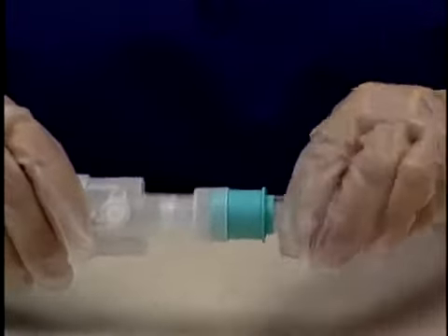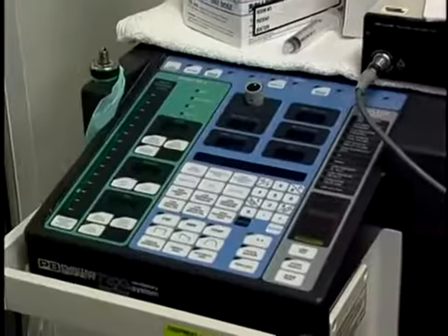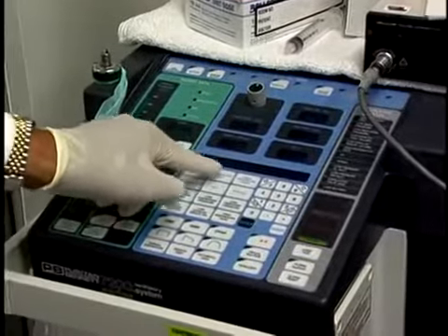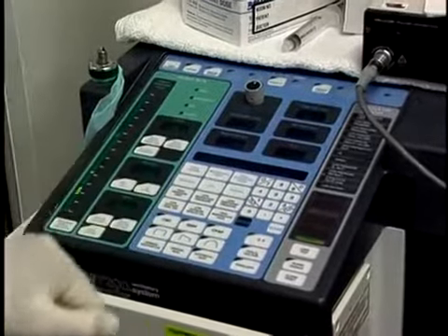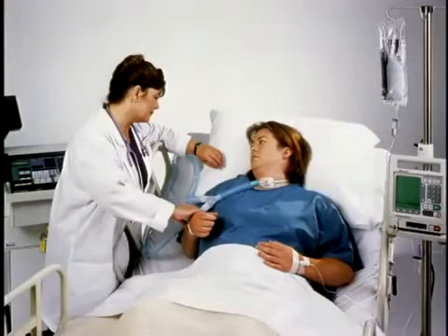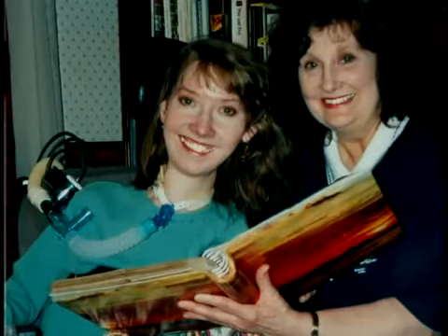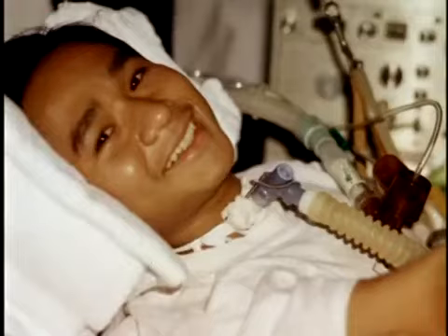As mentioned earlier, you may need to make some ventilator adjustments, which may include volume adjustments during cuff deflation and possible volume, pressure, and apnea alarm adjustments. Portable ventilators have pressure alarms, but do not have the volume and apnea alarms that are typically found on acute care ventilators. Therefore, the only adjustment necessary will be made to the pressure alarms. Acute care ventilators have a combination of volume, pressure, and apnea alarms. The volume and apnea alarms can be reset manually when the patient will only be using their valve for short periods of time.